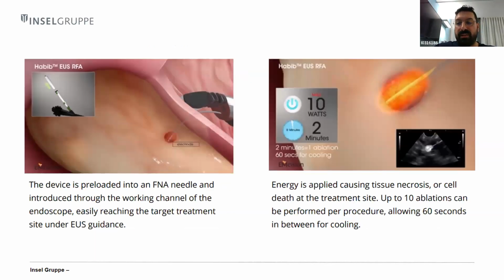So RFA has been successfully used in dysplasia and solid tumors in multiple facets of gastroenterology and oncology, including esophageal adenocarcinoma and hepatocellular carcinoma. Endoscopic ultrasound enables the application of RFA in the pancreas, which offers precision and minimal invasiveness. In addition, it is believed that RFA elicits a systemic immunological response, which could contribute to a durable response. The efficacy of EUS RFA for various pancreatic lesions still needs to be elucidated, given the small sample size and lack of long-term follow-up in the currently reported studies.